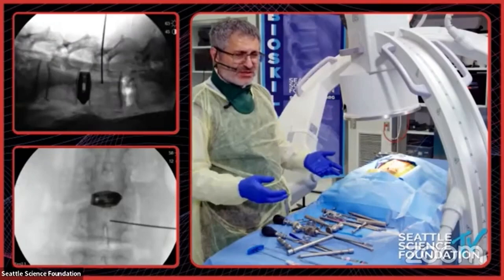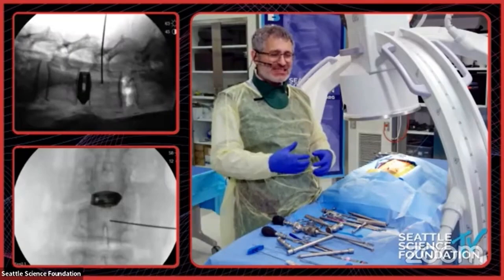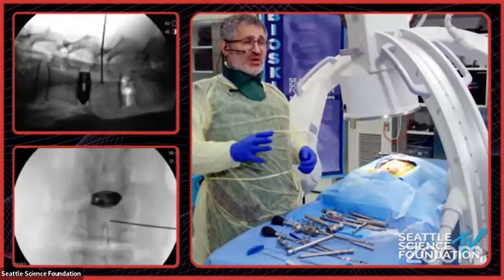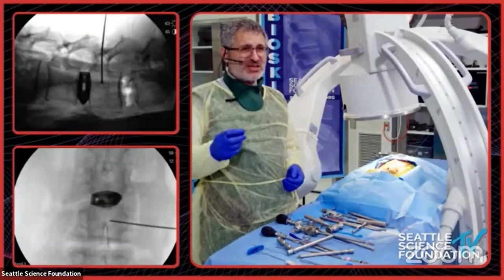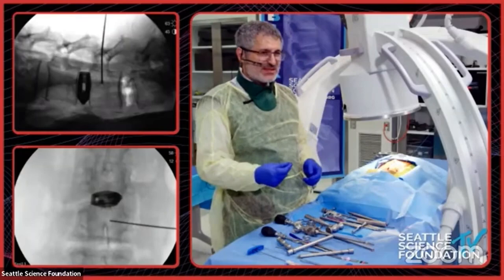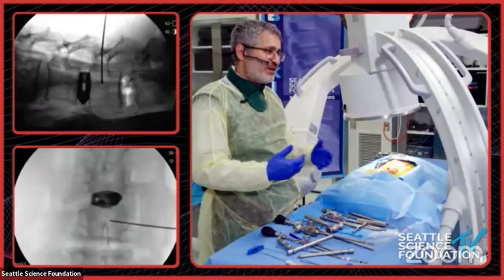This is ready for the screw — I don't tap for the screw, I don't do anything else. I just put my screws. I use screws that are very dull tip and dull threads — they sort of center themselves and are less likely to cut through the cortical bone. I learned from my orthopedic colleagues that it's actually a good thing to put bicortical screws, especially in patients with soft bone. The tip of the screw will engage about half a centimeter into the cortical bone of the other side. I rarely or never use a power drill — I use my feeling to know when I'm going through structures. That's actually it. Thank you.